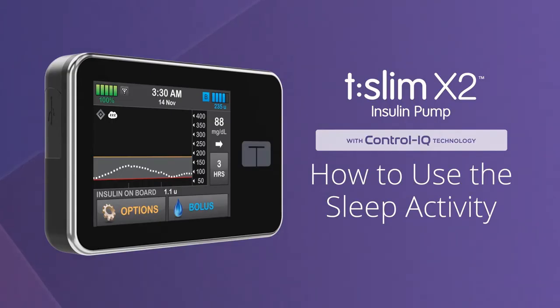Welcome! We're excited to show you how easy control can be while sleeping, using the sleep activity feature of Control-IQ technology from Tandem Diabetes Care. To learn about how to use Control-IQ technology while exercising or without using any activity settings, please watch our other videos.